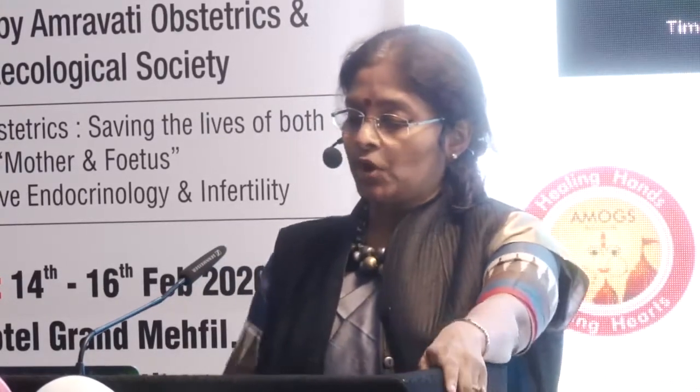Remember, third trimester scanning cannot be used for pregnancy dating, and it should not be performed for that, because there is an inaccuracy of ultrasound in the window of plus minus 3 weeks. There is always a plus minus 3 weeks if you are going to date. Well, if a patient does not have a first and a second trimester scan, then we might have to consider the third trimester scan. The third trimester scan is aimed primarily at assessing the growth and the amniotic volume.